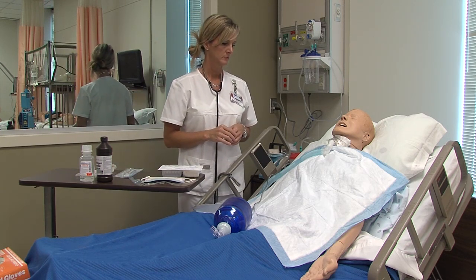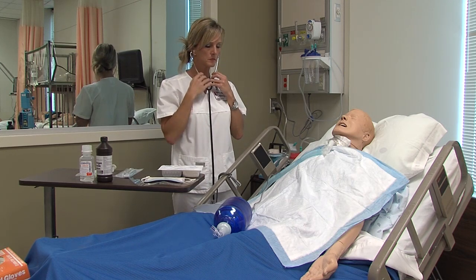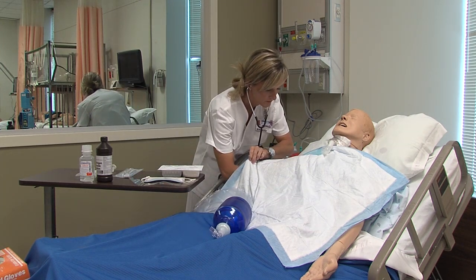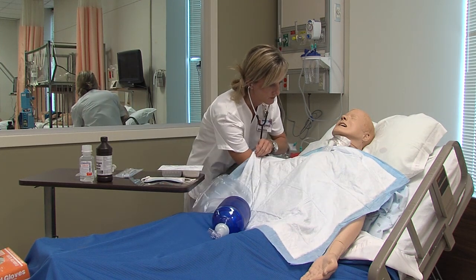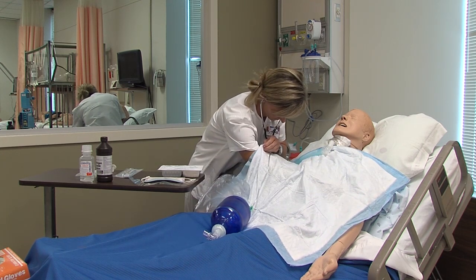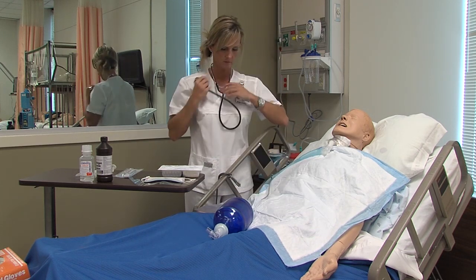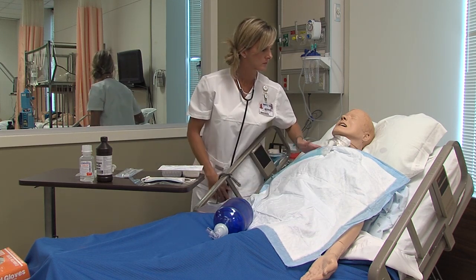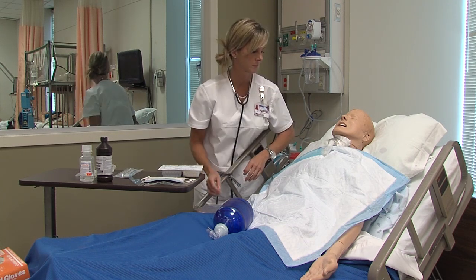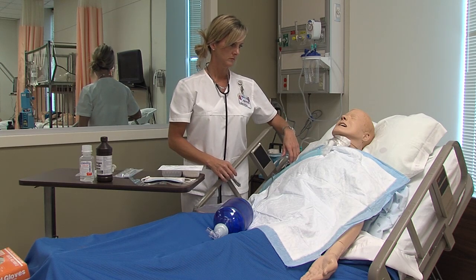Assess your client to determine the need for suctioning prior to beginning the procedure. Make sure your patient is in semi-Fowler's position. Explain the procedure and establish a means of communication.